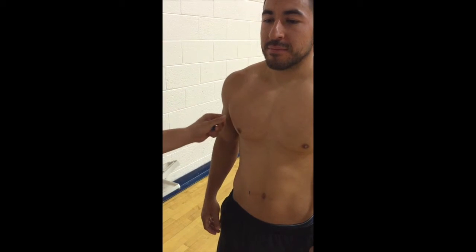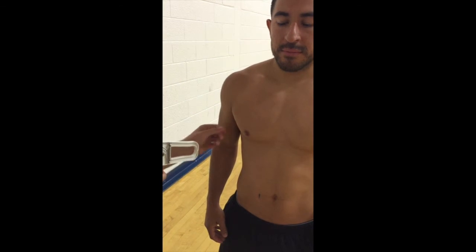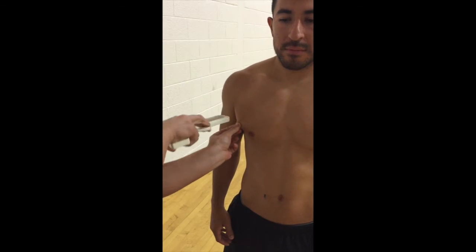The chest and/or pectoral skin fold is a diagonal fold 1/2 the distance between the anterior axillary line and the nipple for men, or 1/3 of the distance between the anterior axillary line and the nipple for women.